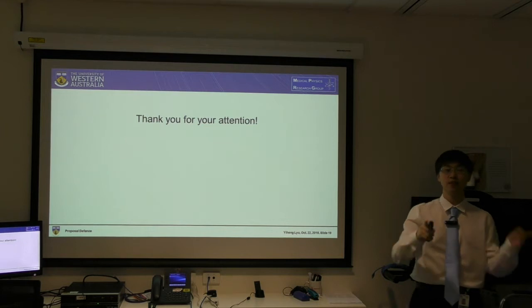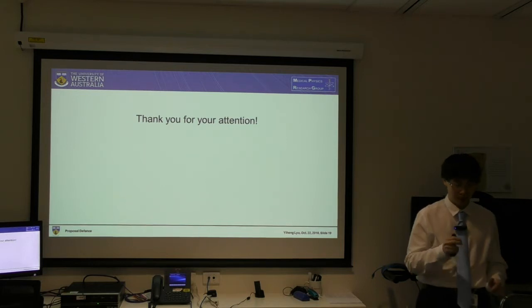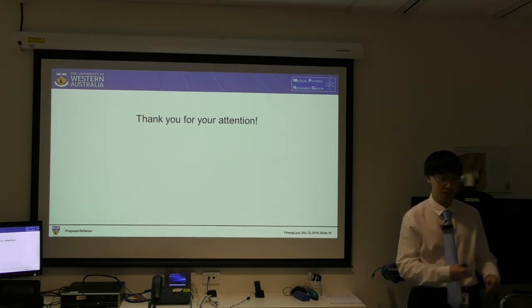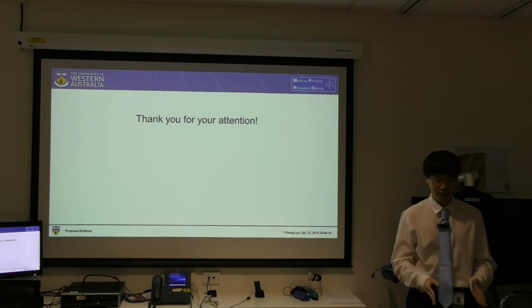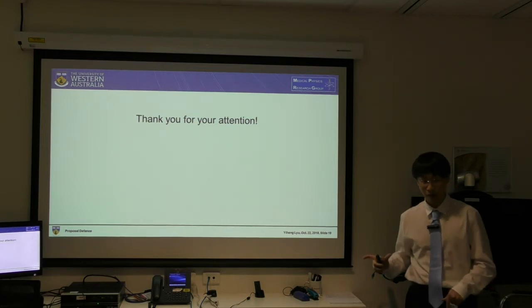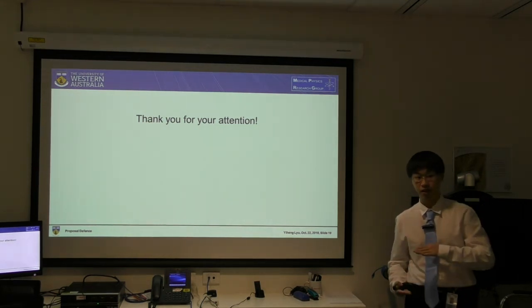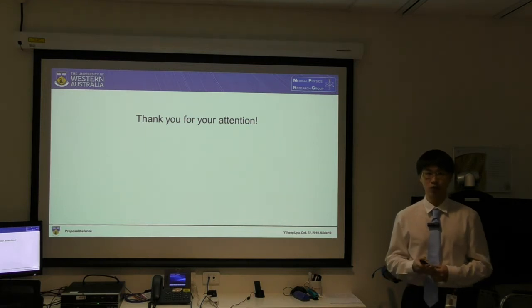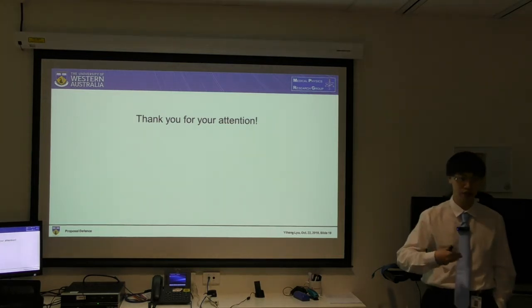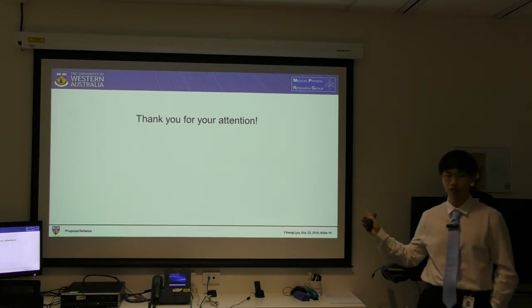And I'm also using the whole 360 degrees of gantry angle, so I'm not trying to build a relationship with both parameters, gantry angle and collimator angle, changing. I'm going to keep the gantry angle fixed and change the collimator angles and see what's going on. But if I want to find the relationship with different gantry and collimator angles, I need to fix the gantry sag. Two of our previous students, Luke and Brandon, their works are partly on this. So I will read their theses and borrow some conclusions from them to fix it.